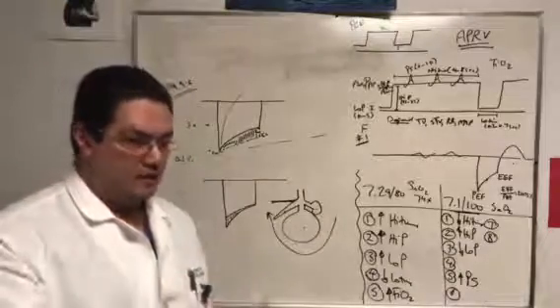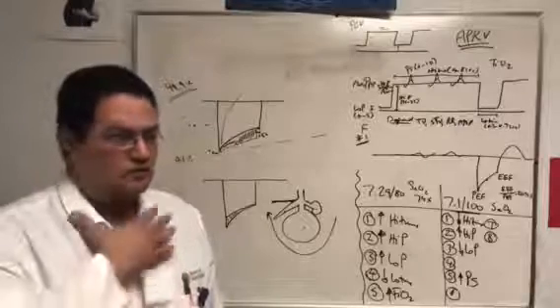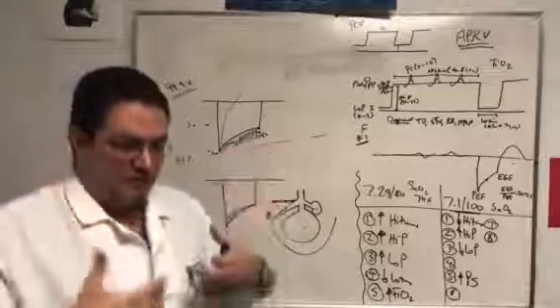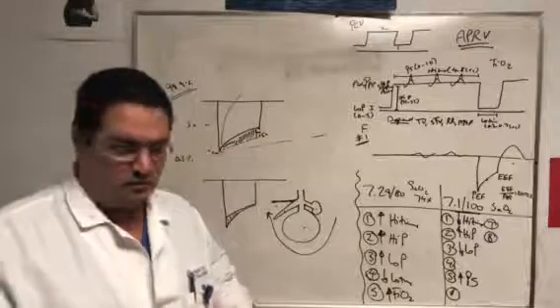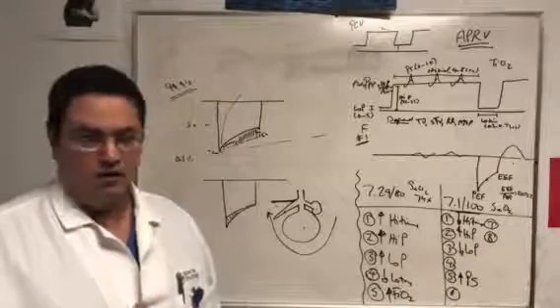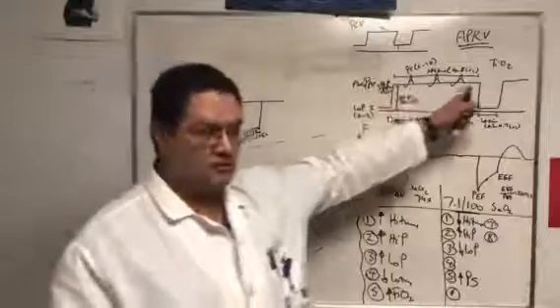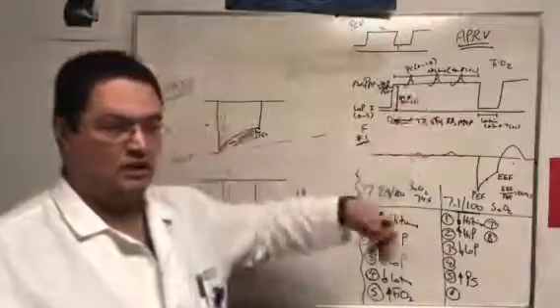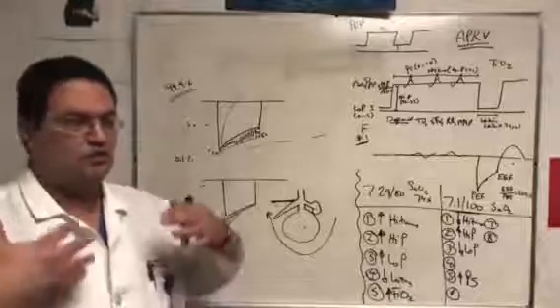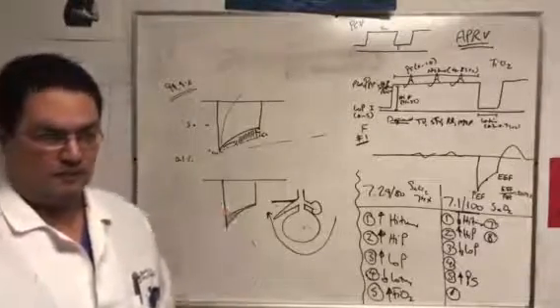And when there's a positive pressure going in the lung, what happens is that it goes in a path of least resistance, so it over-inflates these alveoli and under-inflates West zone number 3, which would be the least inflated. So it exaggerates the pre-existing VQ mismatch. This mode of ventilation, because there's a lot of spontaneous breathing here, it will allow improvement in VQ match, right? Because the negative pressure breath is much better distributed throughout the lung, right?